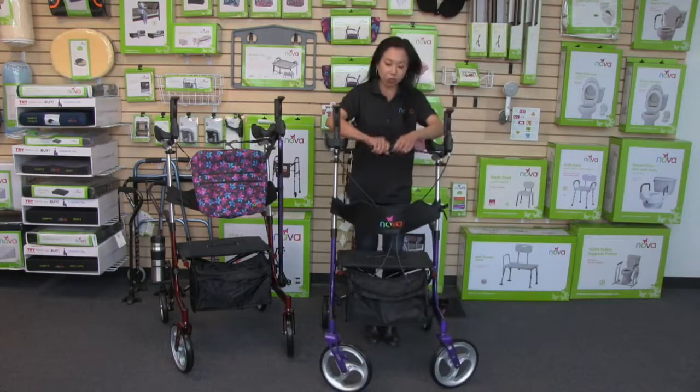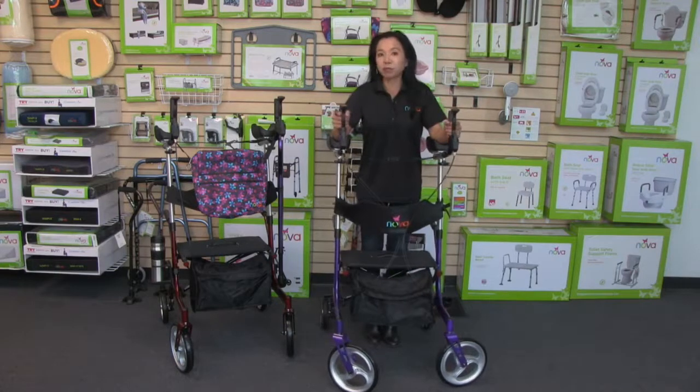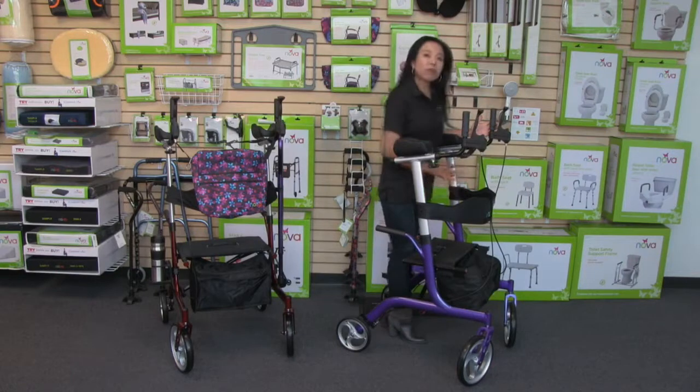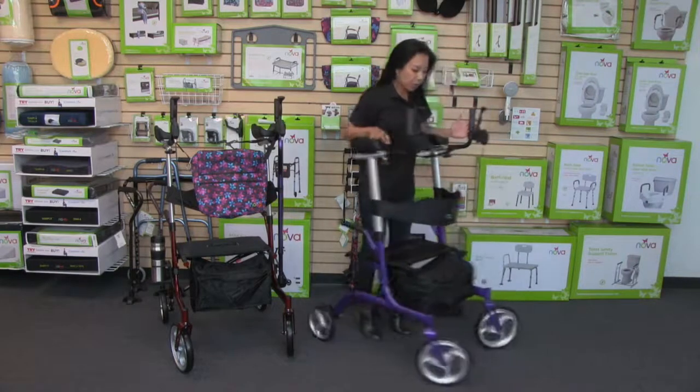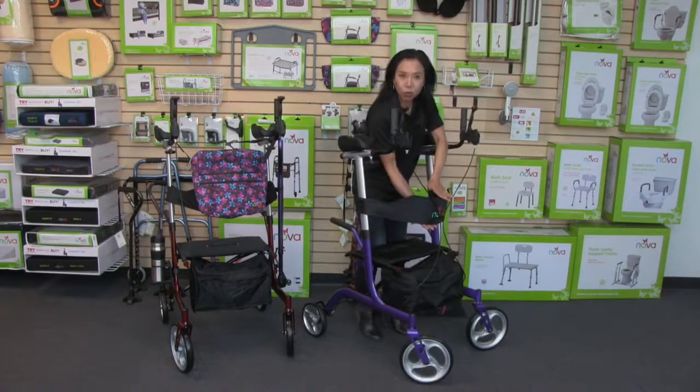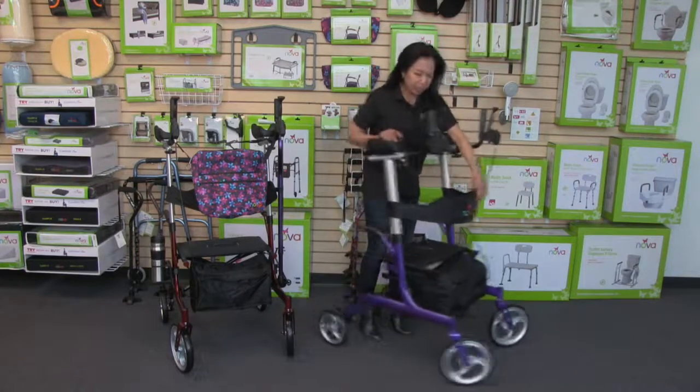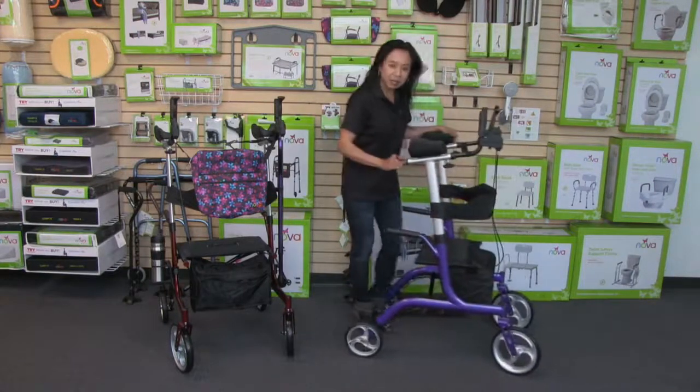There is a stabilization strap that is really easy to secure to give optimum stability on the platform. It also comes with a very comfortable seat and backrest. You'll notice that we have an extra-wide backrest, cable holders to keep your cables nice and neat, and a lightly padded seat and handles.